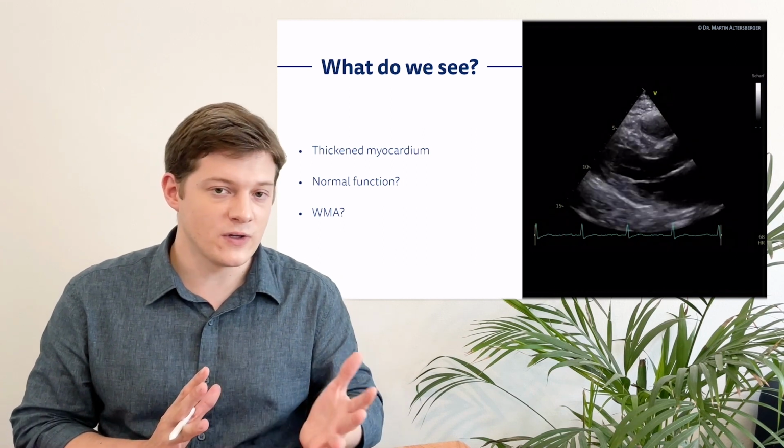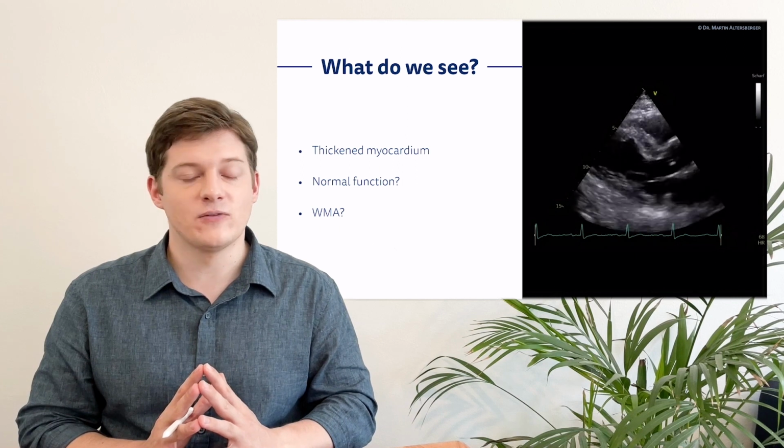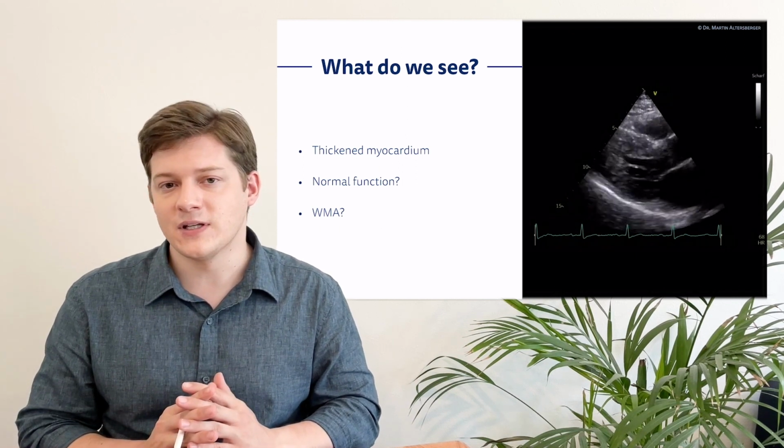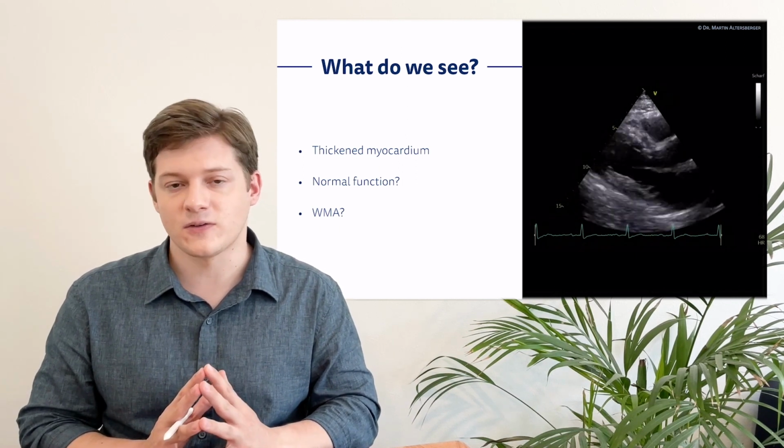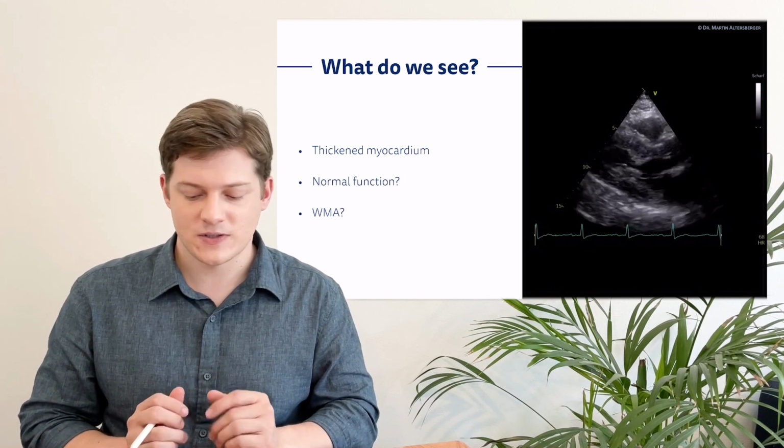You can also alternatively use M-mode. I have to admit that in these cases, I never use M-mode, sometimes only for teaching purposes to visualize the structures a little bit better, but overall measure it in a 2D image.